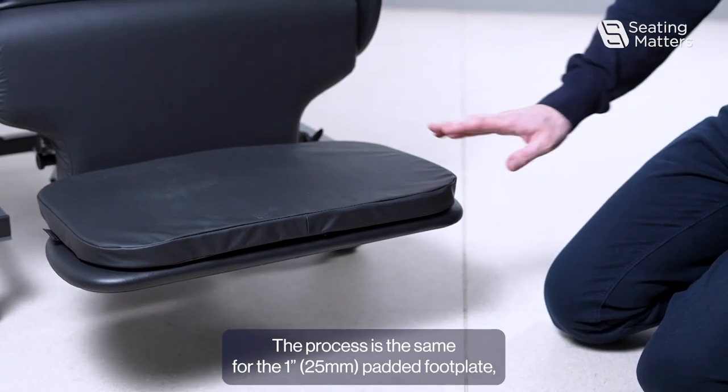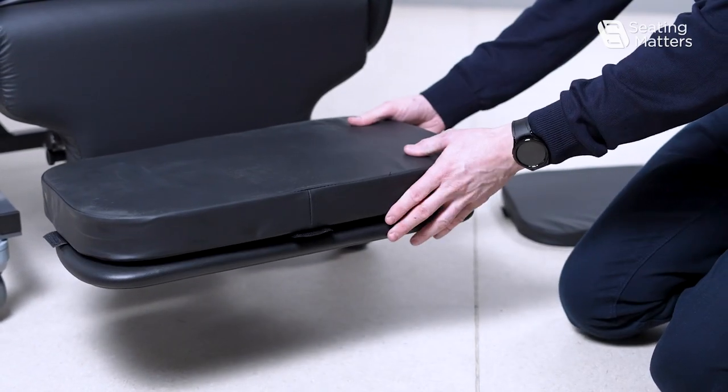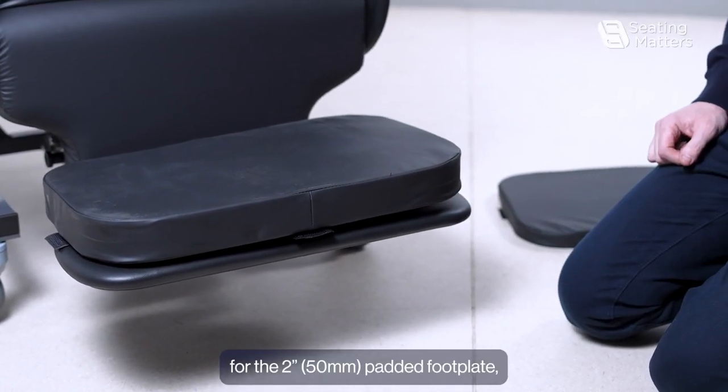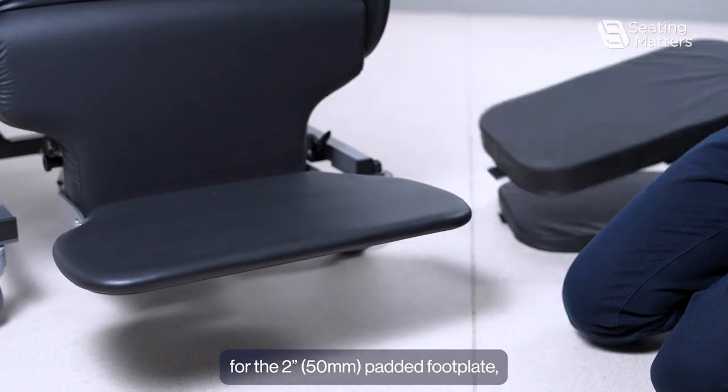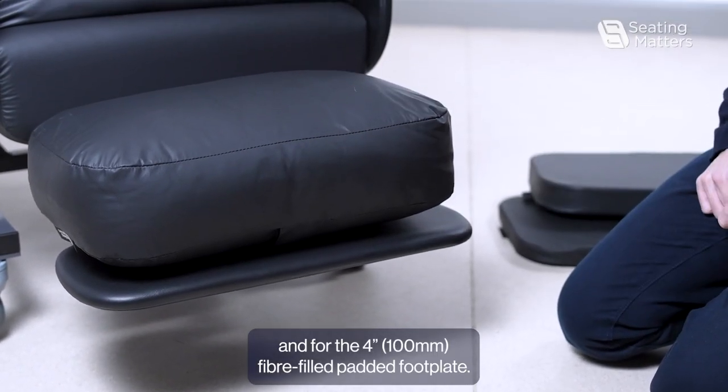The process is the same for the 1 inch padded footplate, the 2 inch padded footplate, and the 4 inch fibre filled padded footplate.